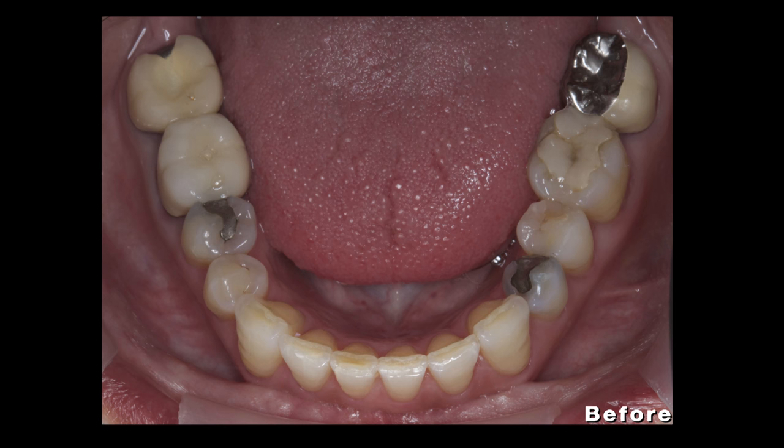Hello, everyone, and welcome to Chairside Live. This is a clinical case of a 48-year-old patient that presented with multiple defective restorations on first and second endodontically treated mandibular molars bilaterally. Secondary caries beneath the amalgam on number 29 was also present.